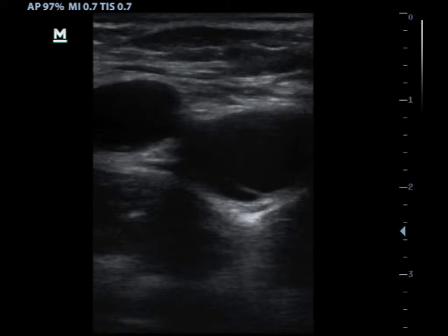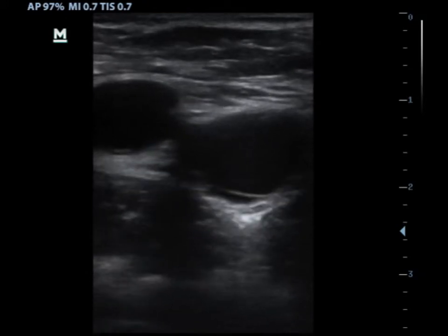So in this picture, I'll tell you, we have the common femoral vein, and we have the common femoral artery. Deep to them, we have the psoas muscle. Because we only have the common femoral artery and the common femoral vein, I know that we are quite high up near that inguinal ligament. And this is what they look like.